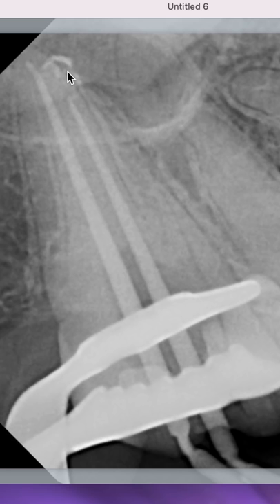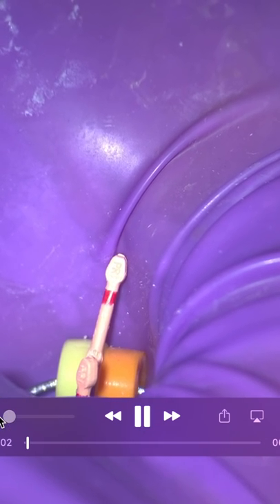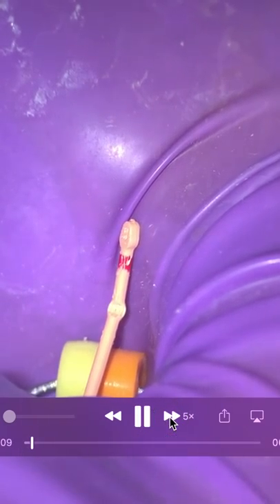Now, I called the patient a day later. It was tender to percussion, and likely the over-instrumentation was part of that. And you can see this is going to be tender as well. So let's go ahead and finish obturating the case. If you made it to this point, I'm super grateful. You made it. So yeah, see there, right there. You can even see it. So the point had slowly made its way out. So what we're going to do is a final rinse.